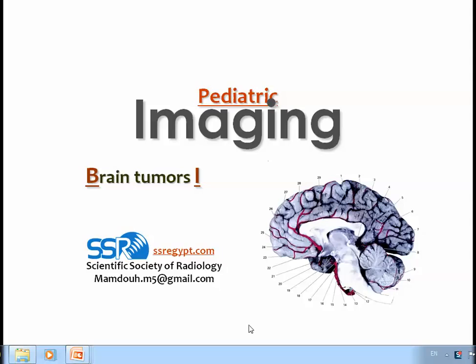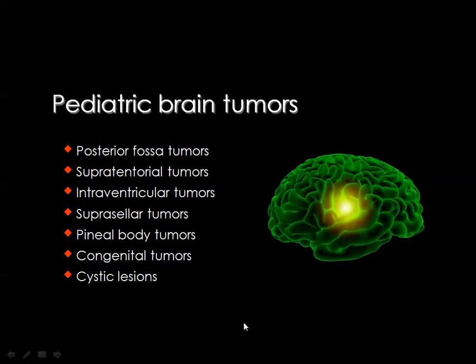This is actually a very long subject, and I will handle it in two separate lectures. The first one will deal with some of the posterior fossa and supratentorial tumors, and after that we will continue with the other tumors. And these are the issues we would like to expose.